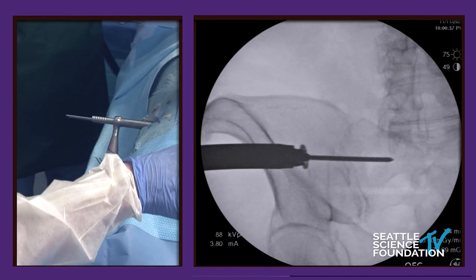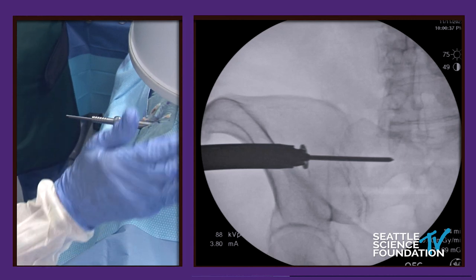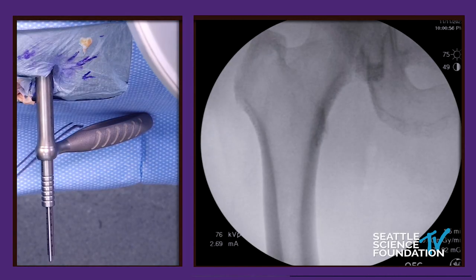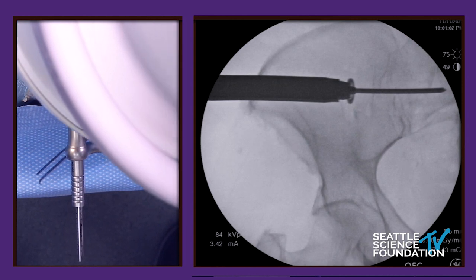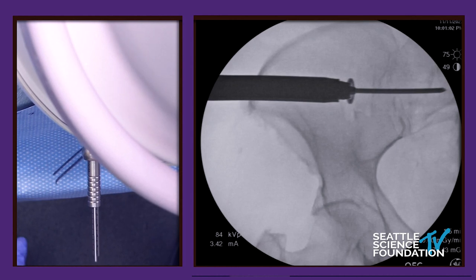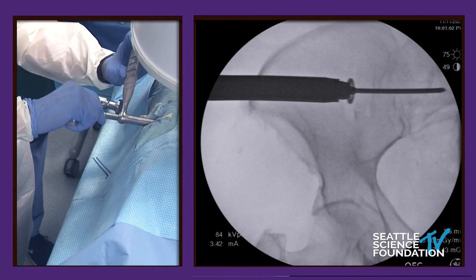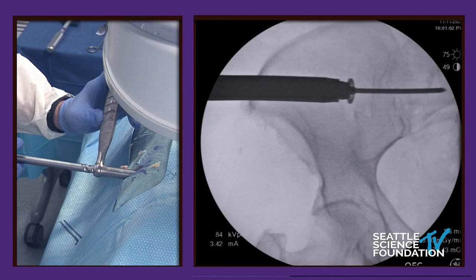Give me a pelvic inlet view. This is like a Ferguson view but with a lot more caudal tilt. This is the pelvic inlet view — we want to make sure we're not too far anterior. The lumbosacral trunk sits anterior, so we need to make sure we're not too anterior. We'll put the working channel in, give it a couple of taps, and take the internal dilators out.